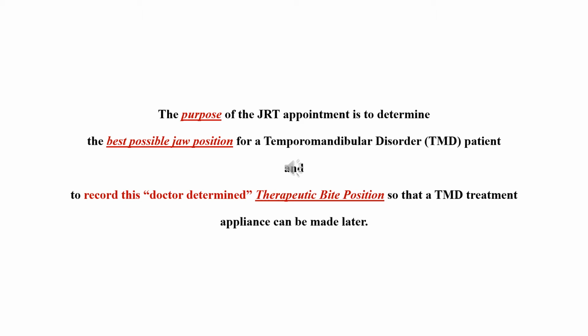The purpose of the JRT appointment is to determine the best possible jaw position for a temporomandibular disorder patient, this particular patient, and to record this doctor-determined therapeutic bite position. I determine it. Therapeutic comes from therapy; we're doing therapy.